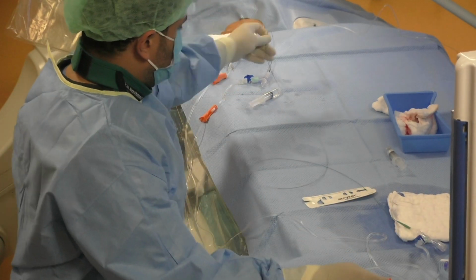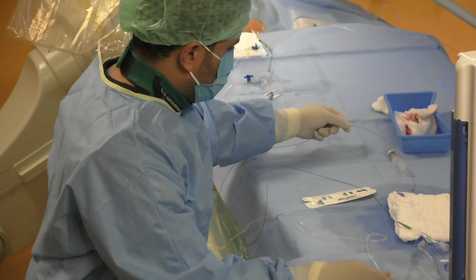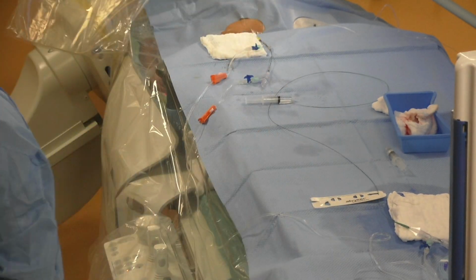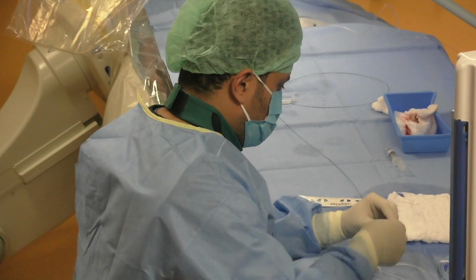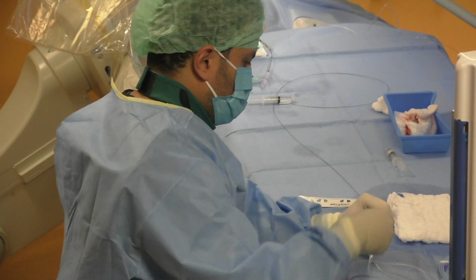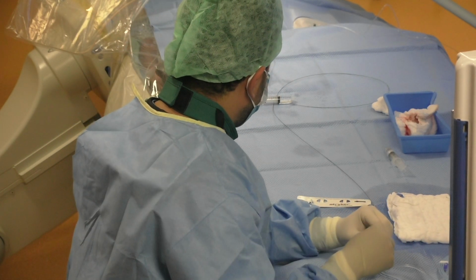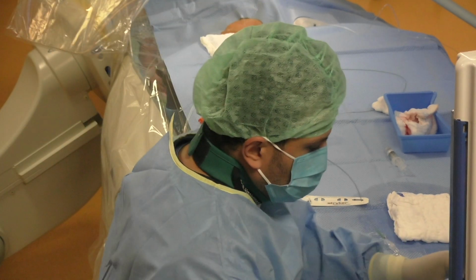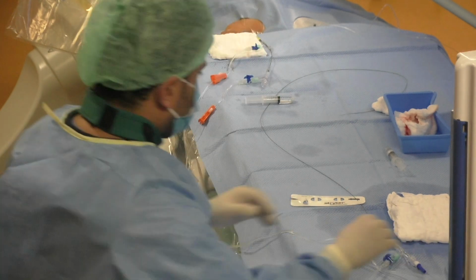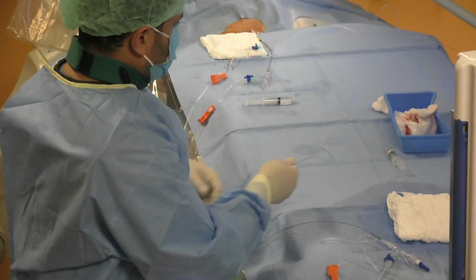And now we need the microcatheter with the microwire again to navigate the left middle cerebral artery, including the aneurysm. And now we're pushing the microwire into the microcatheter. We need a new shape at the tip of the microwire, a little bit sharper than before.